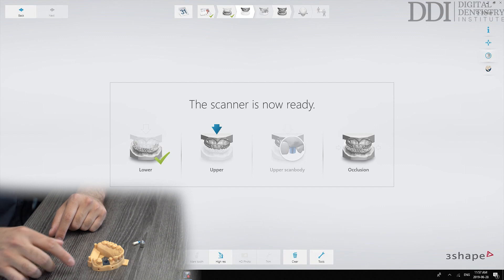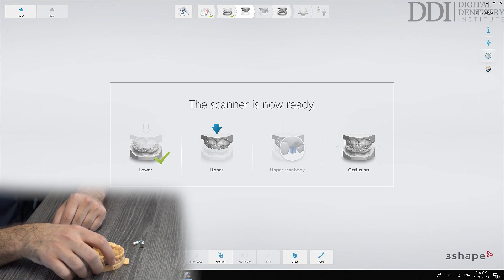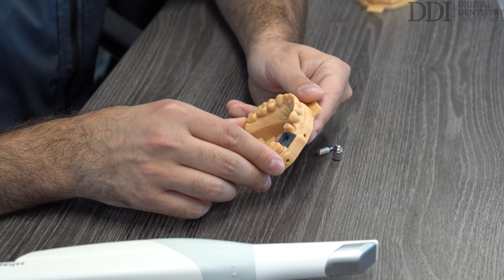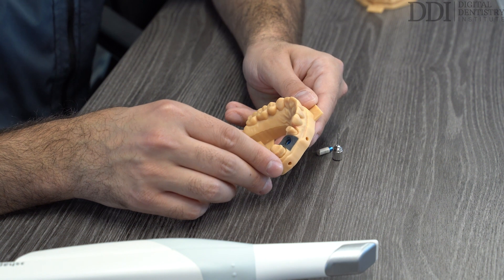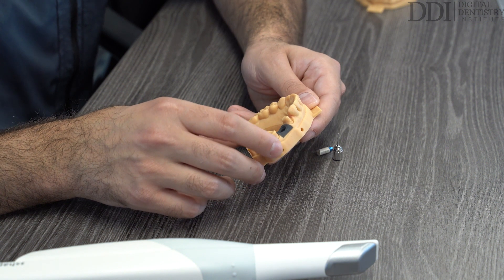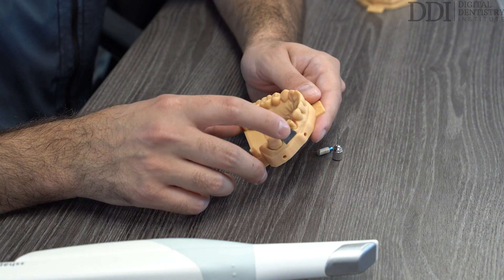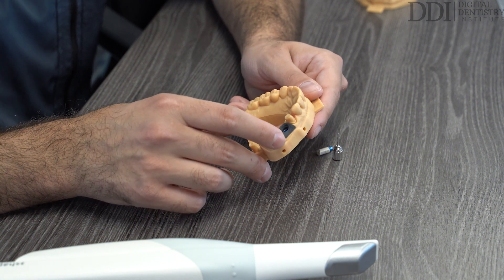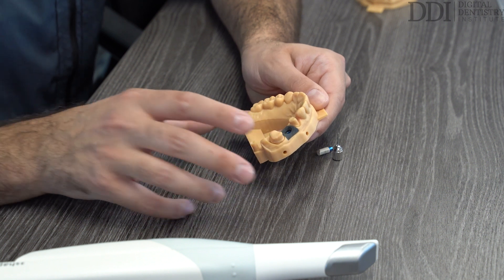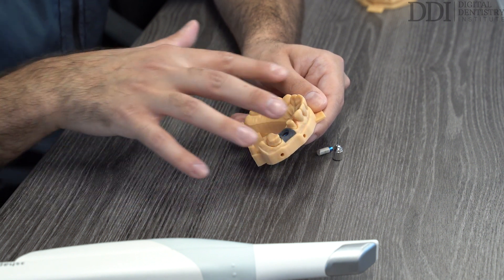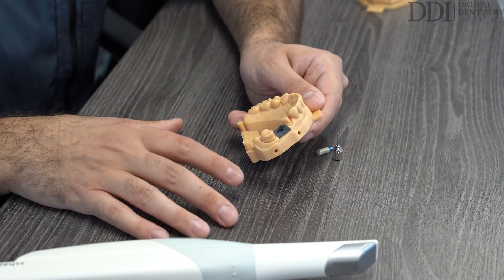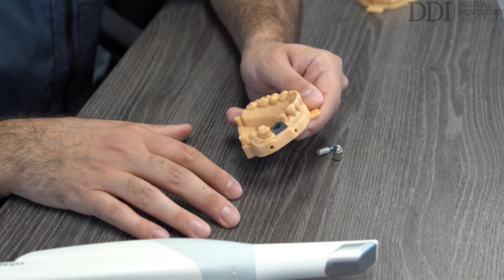So what that means is that for the first upper scan we'll have our patient in this situation where we've removed the healing abutment or provisional crown and we're ready to scan the emergence profile prior to inserting the scan body.